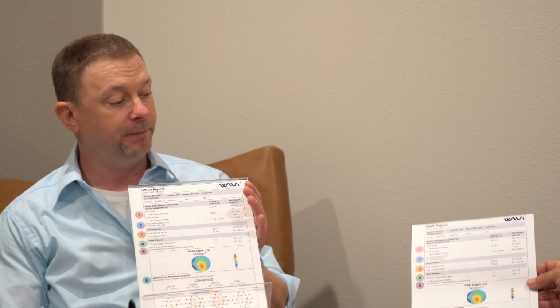You'll also see on the report the different ratios that we talked about a little earlier. If you saw the earlier section, there are ratios that are described, and those ratios are up here in this area, describing different parts of the brain and different brain waves. We have some reaction times and speeds and voltages here, and then we also have the color map of the P300, and we have the coherence map of all the different sites of data collection and how they're linked together, and if they're overconnected or underconnected.